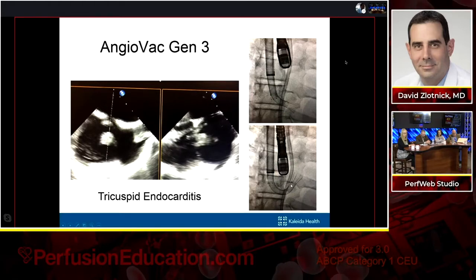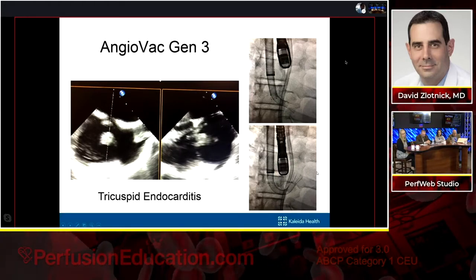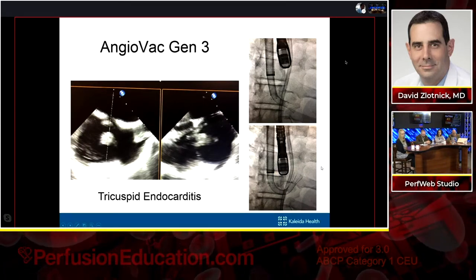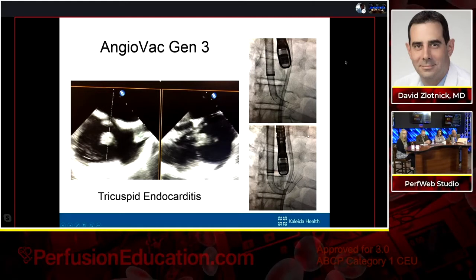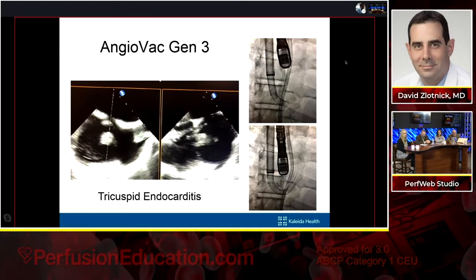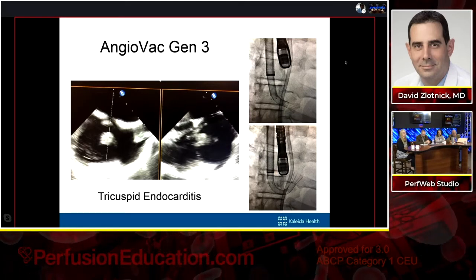And just to show the amount of bend that we can make right here and to really go after the tricuspid annulus and continue to debulk, this procedure time, we looked at this. We had the AngioVac catheter in the patient for less than 14 minutes. And our stick to closure time was less than 45 minutes with this device. So it really made it quicker.